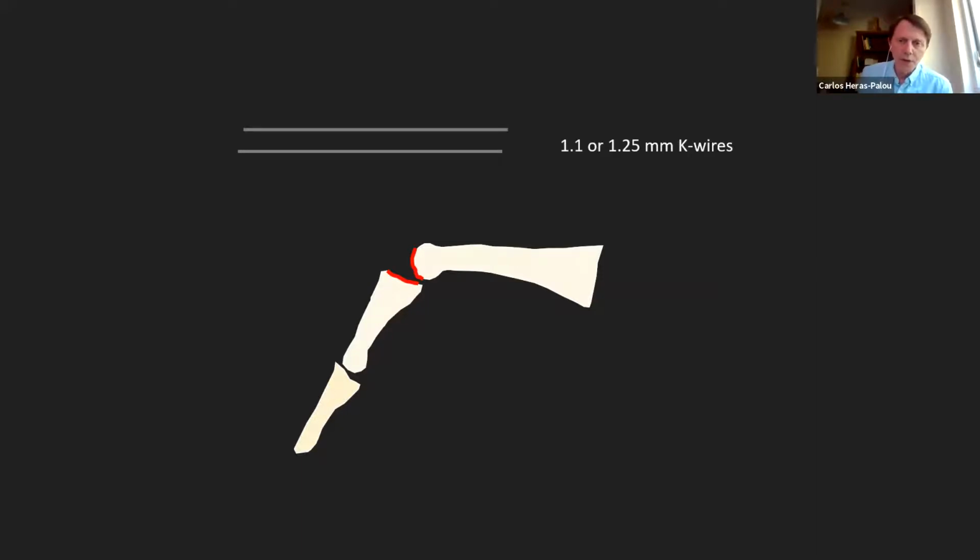And then use a couple of K wires, 1.1 or 1.25 millimeter diameter K wires are great. And what we do then is make a transverse hole in the base of the middle phalanx and pass some surgical malleable steel wire. In the hospital, they usually have two types of wire. They have surgical steel malleable wire, and they have dental wire. And the dental wire has got a lot of memory. It's difficult to handle. So if somebody offers you the dental wire, say, no, I want the other one, because it's difficult to get your knot buried as well.